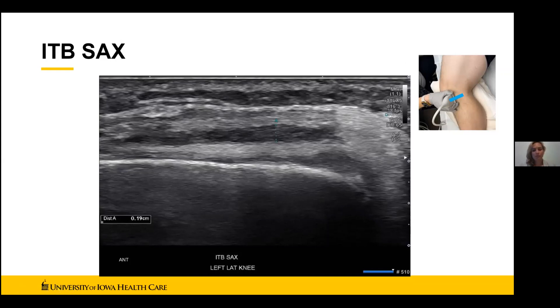Regarding the popliteus — I will start laterally like you did and begin my evaluation there, but I personally prefer to do the rest of the evaluation with the patient prone from the posterior approach. So I'll take a quick peek laterally, but if clinically applicable I'll flip them over to prone and finish my exam there. When looking at the lateral knee recess and lateral meniscus, if clinically applicable — which is the whole point of the series — you could look at meniscal extrusion. If I have concerns for meniscal pathology and want to dynamically evaluate, I'll put the patient in different degrees of flexion and extension looking for extrusion. Just something else to consider if clinically applicable.